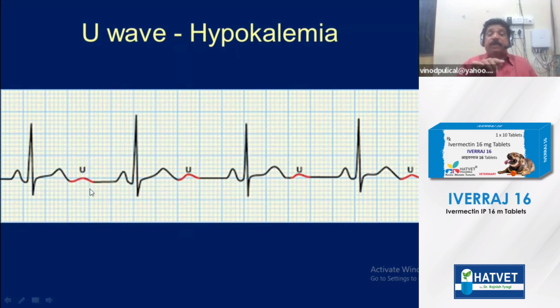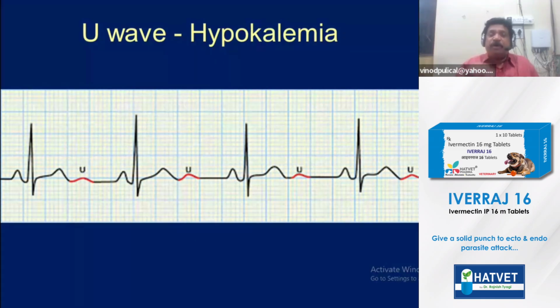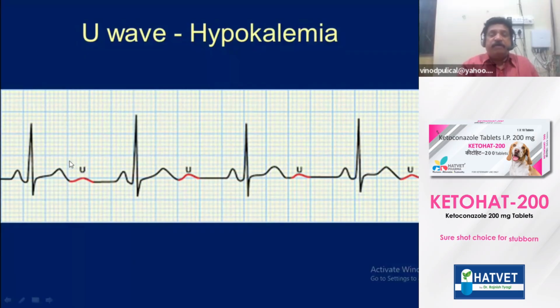And don't get confused that it is a second degree heart block. No, it's a very shallow one only. Very small one, a shallow one. And if at all it is a very large one, it can be hypokalemia. It picks up in hypokalemia.